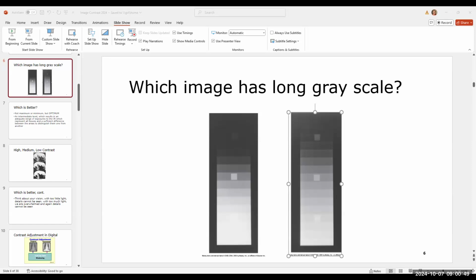You know, the whole concept of changes in distance affects what primarily? The change in distance, what we've been talking about. What does a change in distance affect? Intensity. Well, it does affect exposure indicator too, because of intensity. So intensity is what's changing when the SID changes.